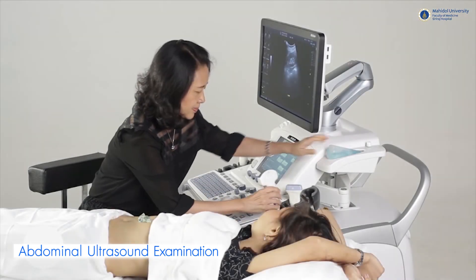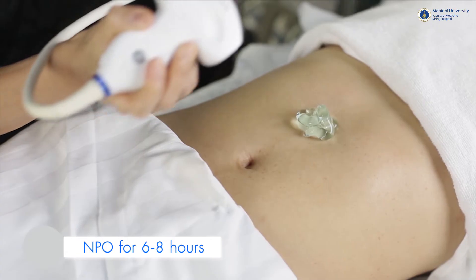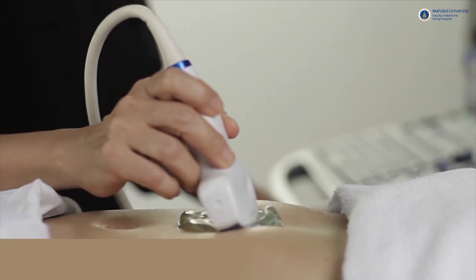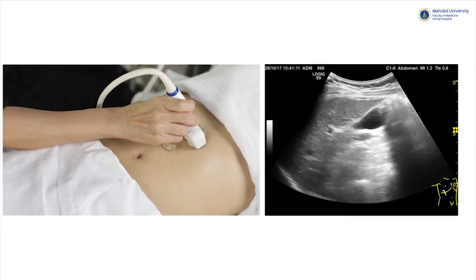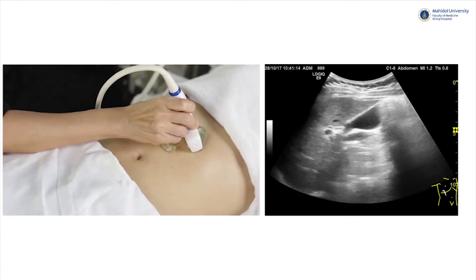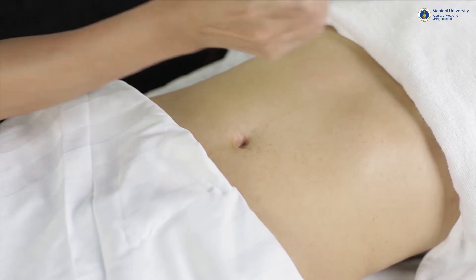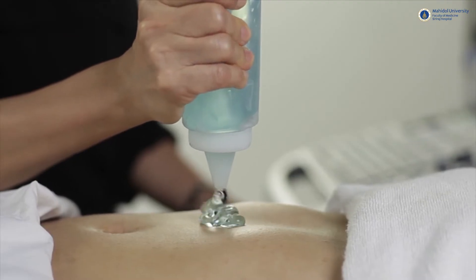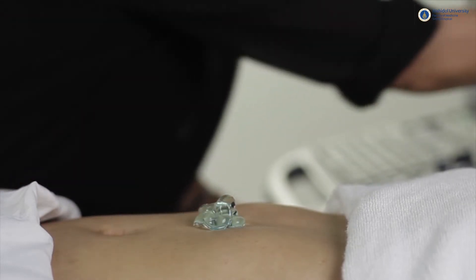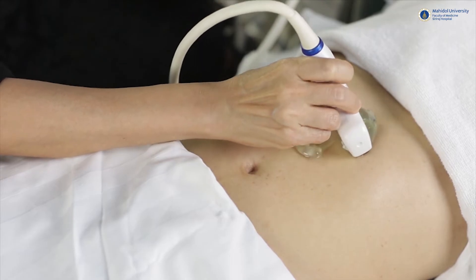During abdominal ultrasound examination, the patient should fast for at least 6 to 8 hours before the scan in order to prevent gallbladder contraction and to avoid bowel movements, which could potentially obscure the organs under study. An optimal amount of gel should be used, serving as a medium and allowing the probe to make good contact with the skin to achieve the best possible images.